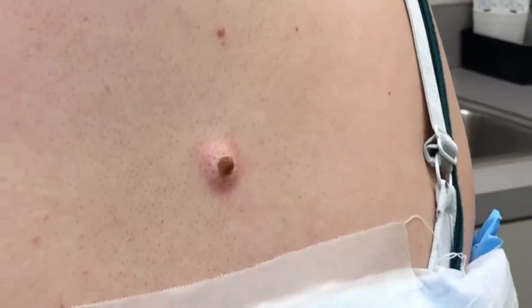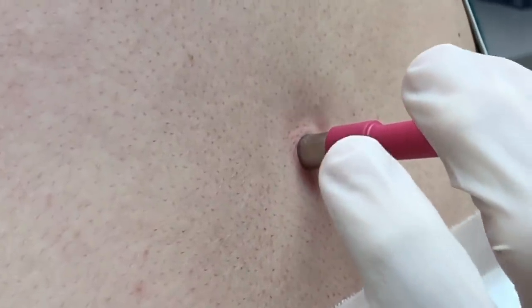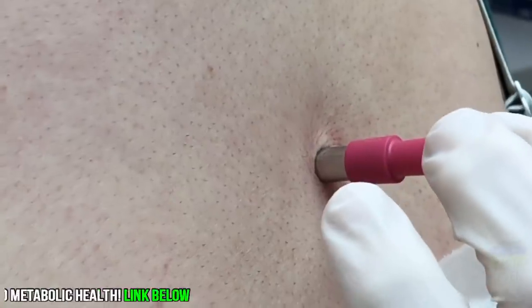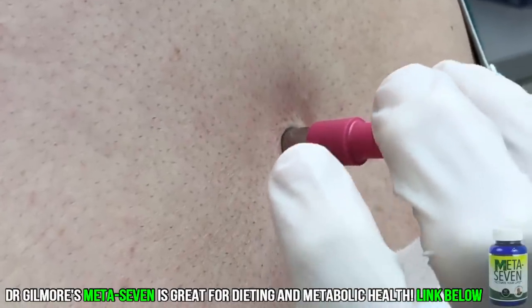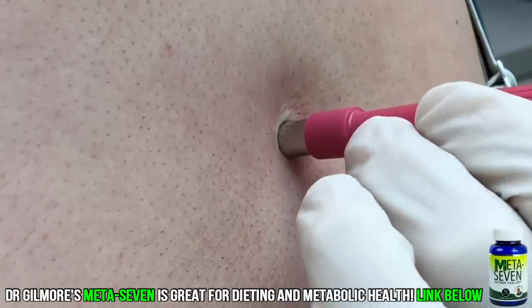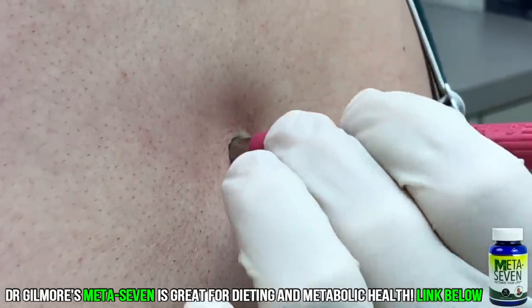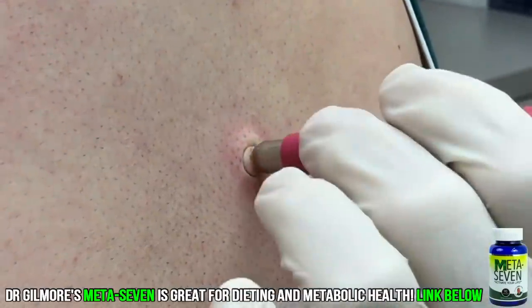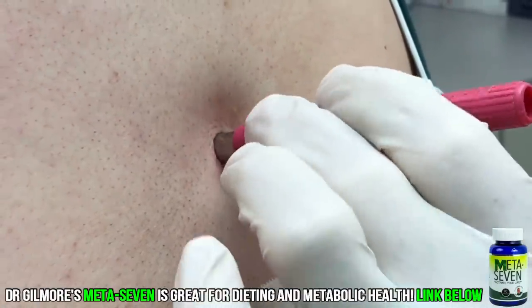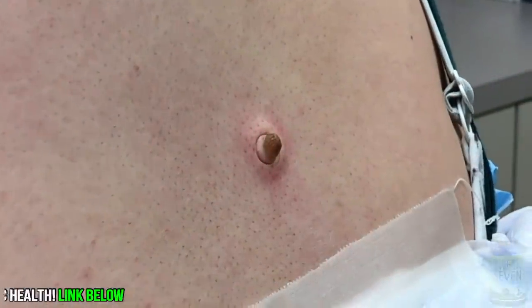Pretty cool. All right, so we're going to put that right over the mole and then just twist gently. You feeling anything? No. You might feel a little pressure, but you shouldn't feel any pain. If you feel any pain, say, I felt that. Make sure that we have it. Make sure we're deep enough. That should do it right there.